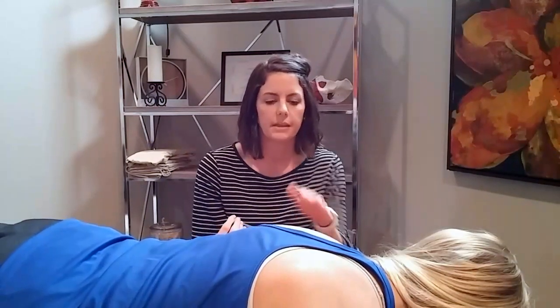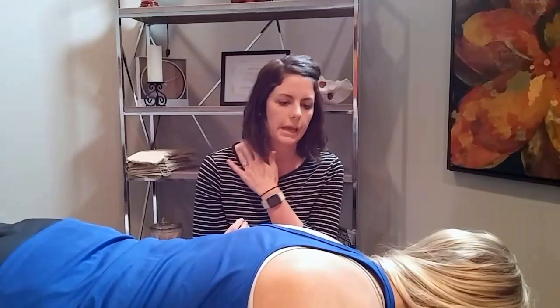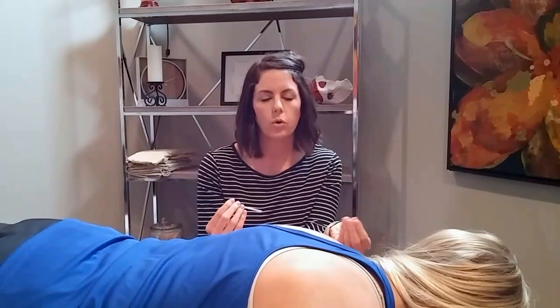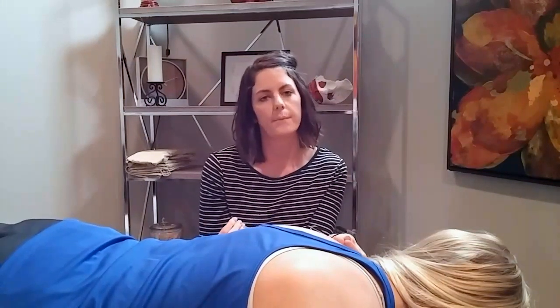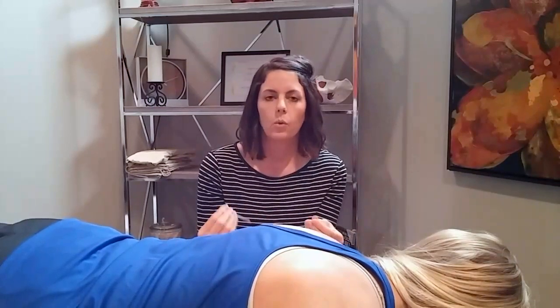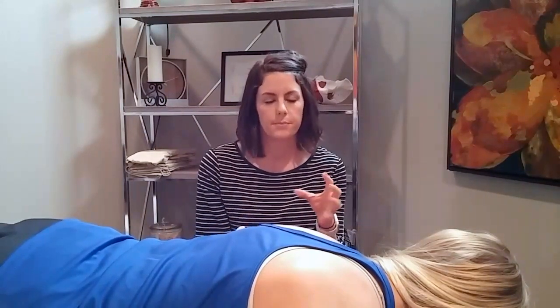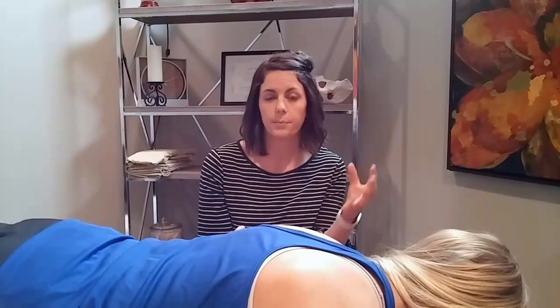So if someone comes to me like Nikki here, and they're having shoulder pain or upper neck pain, for instance, what I would do is I would hold on to those tissues, find that trigger point in that pain generator, and we would tap the needle right into that trigger point. Once we do that, it will elicit what we call a twitch response. And what that twitch response is, is the muscle kind of spasming a little bit to pump out those chemicals that are stored within a trigger point.